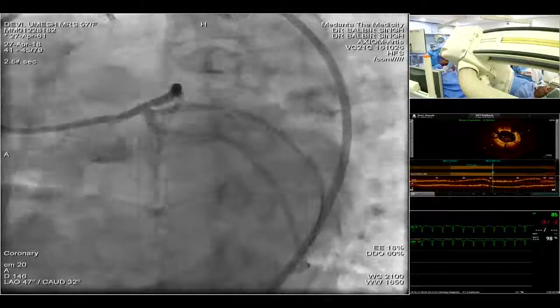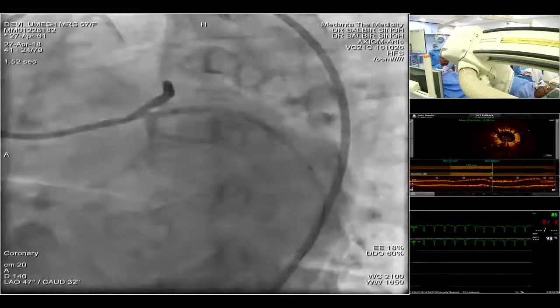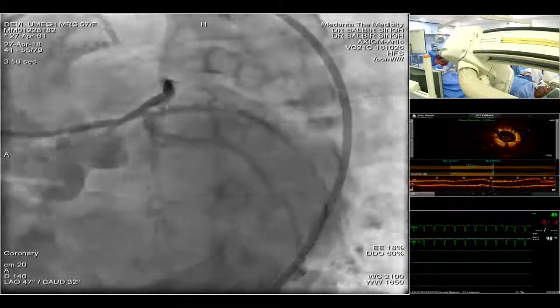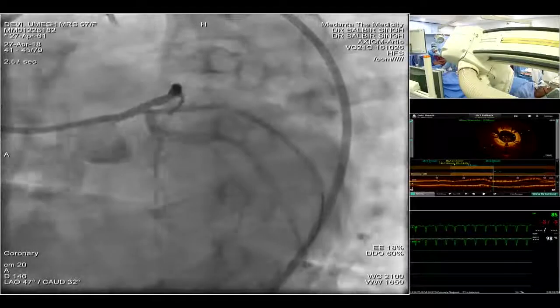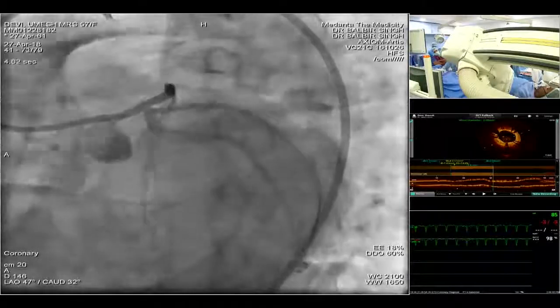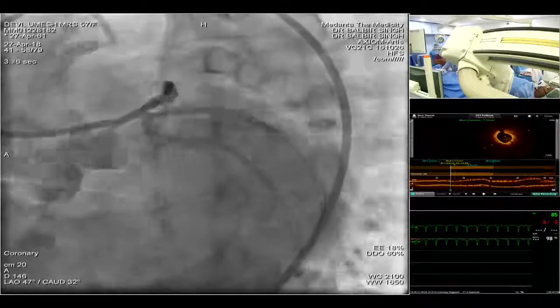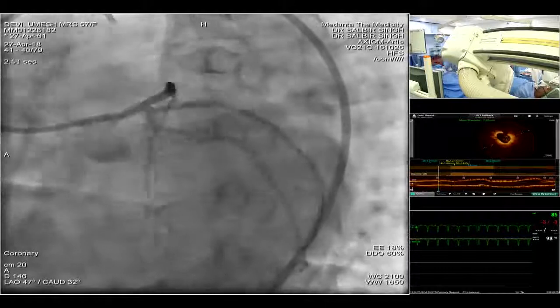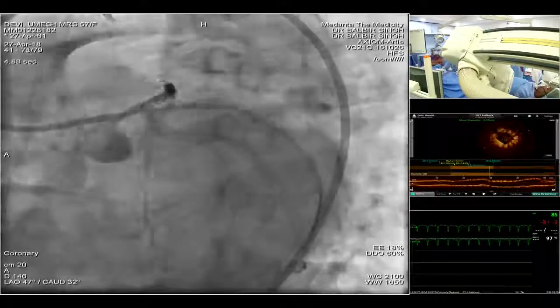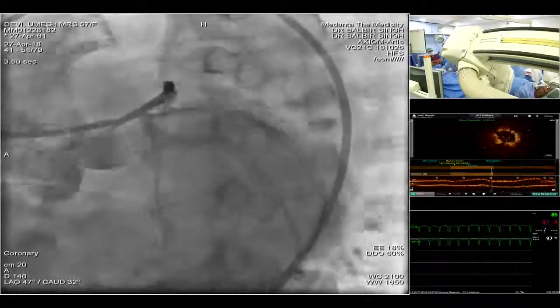Dr. Singh, congratulations on this excellent case. It was very educative both for the revascularization strategy and also for the PCI itself. I'd like to congratulate you and your whole team for this beautiful procedure. Thank you so much. And I'd like to ask the audience and my partners at the panel whether anybody has questions.